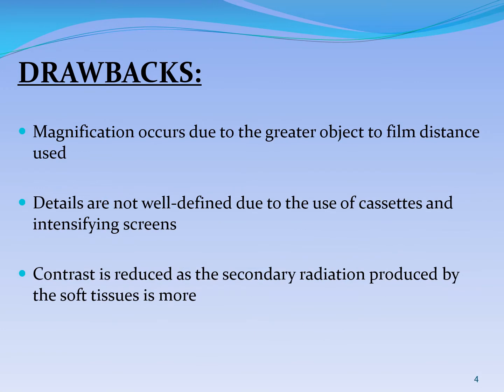The drawbacks, first and foremost, is the magnification because of the greater object-film distance. Details obtained are not as well defined as seen in intraoral periapical radiography or intraoral radiography. Contrast is reduced as the secondary radiation produced by the soft tissues is more.